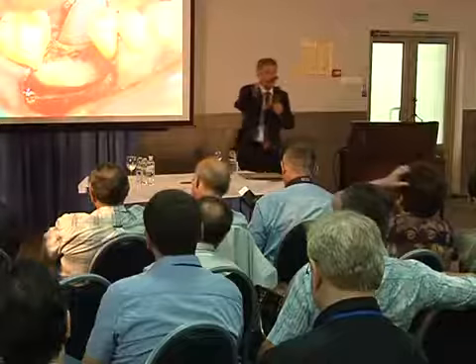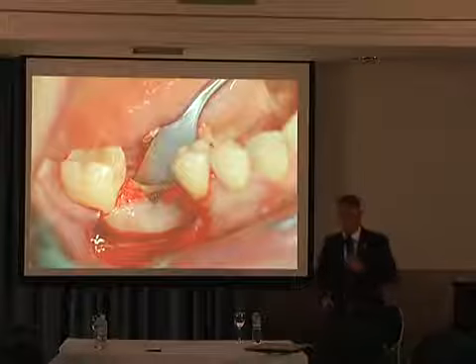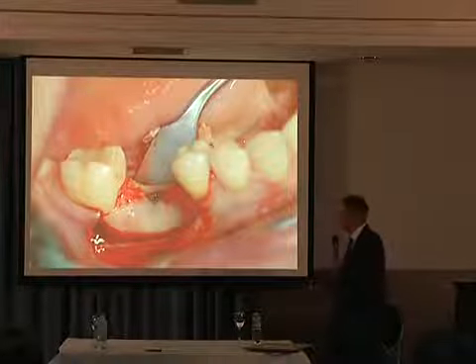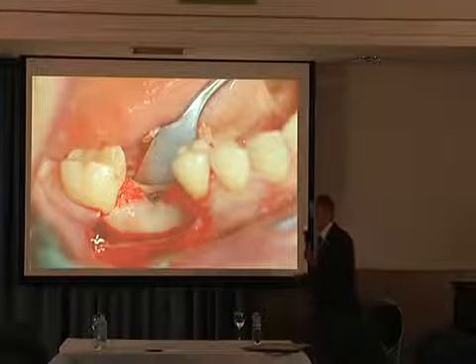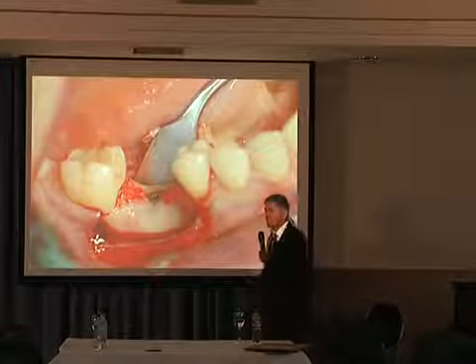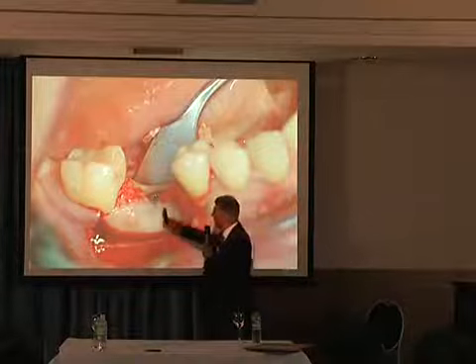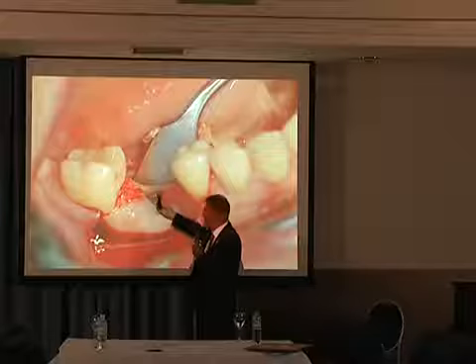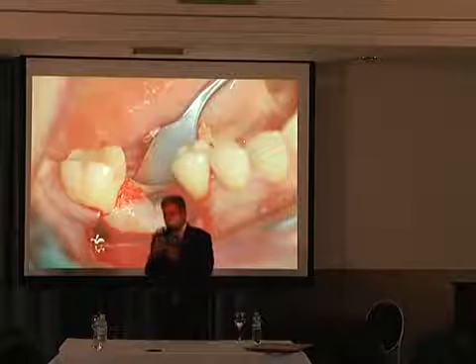We have a vertical bone loss of the buccal blade. He showed you with these two models that when we split the alveolar ridge, the buccal plate moves aside and sinks down, and we get a bone defect in the vertical direction on the cortical plate. Therefore, we place our implant on the buccal side at bone level, but lingually subcrestally, 1, 2, 3 millimeters, depending on how much we split the bone.